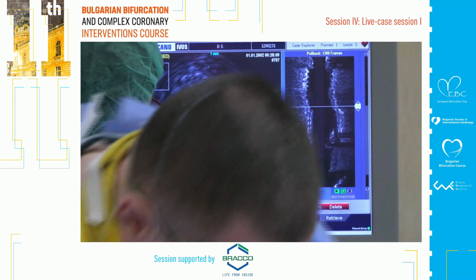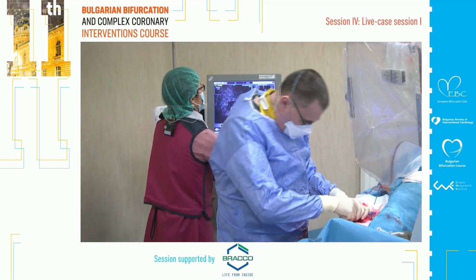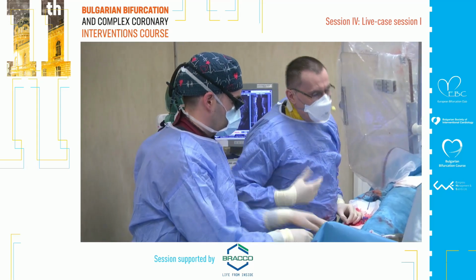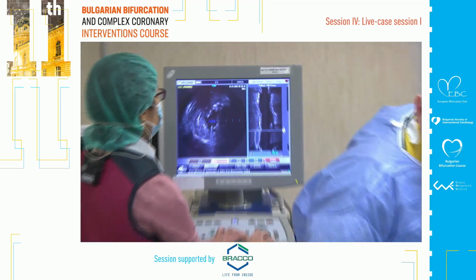That sounds good. Yeah, I had a question about the ostium of the LAD, why there is echo dropout. Okay, which one? Okay, come back. This is the ostial LAD. Right. You're talking about here? That's calcium. I'm sorry, you're talking about here?